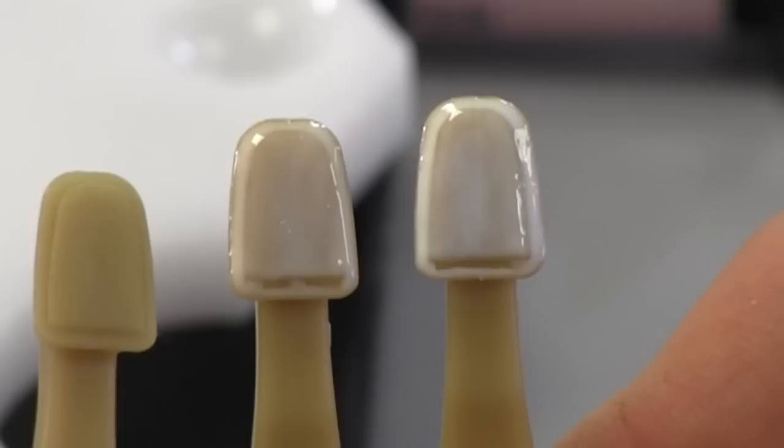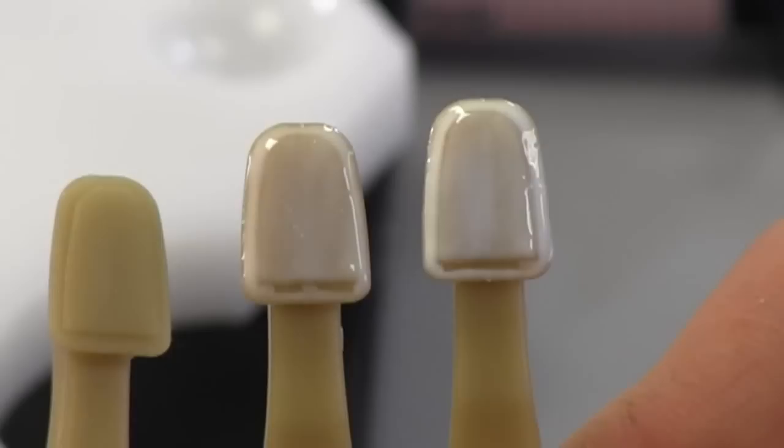By being warmer, when you overlay with your composite — let's say an A1 composite — that will allow the A1 composite to look more natural and lifelike. So when you put your next composite over the top, it keeps the value up.